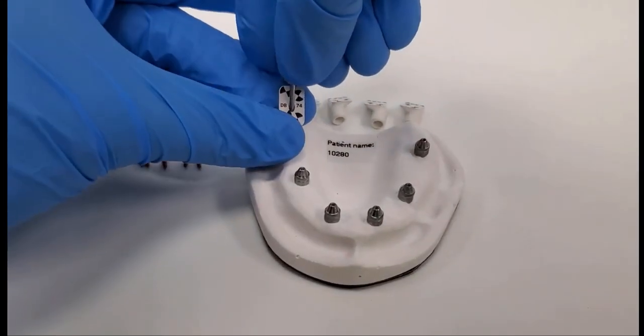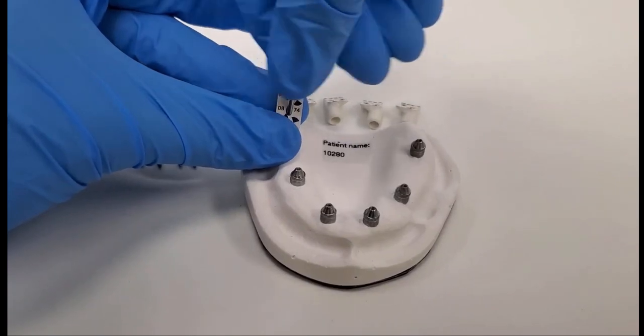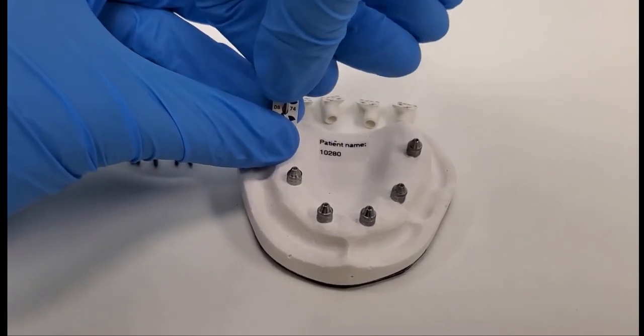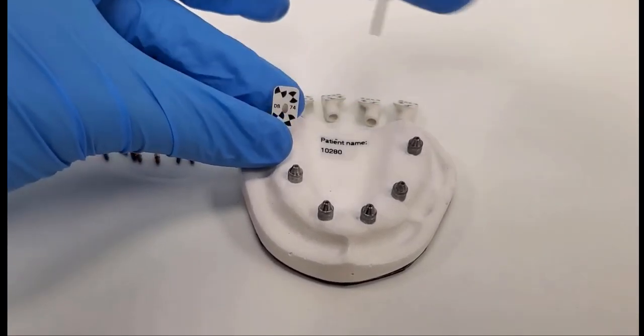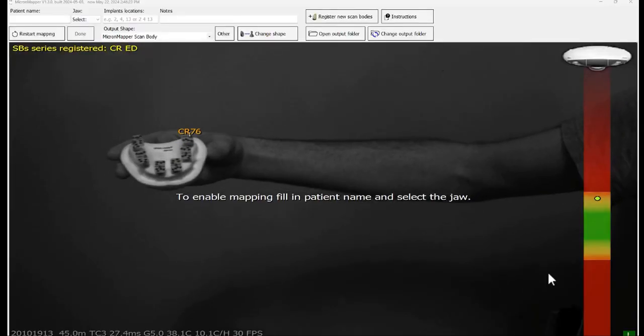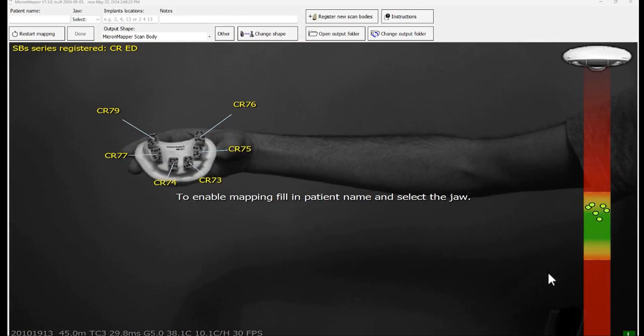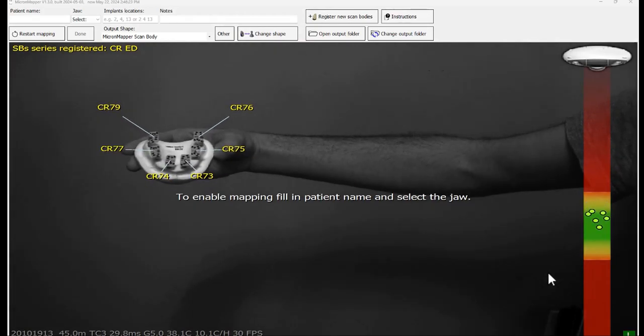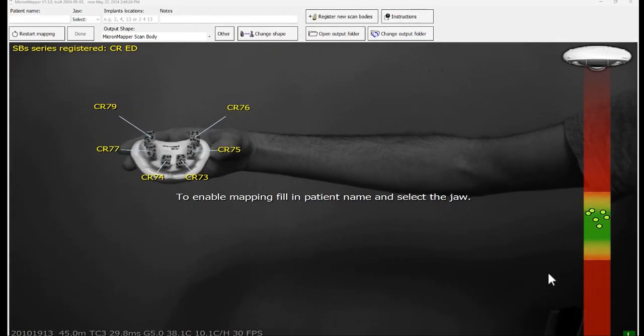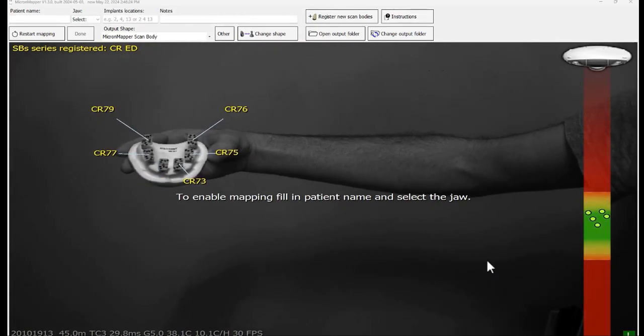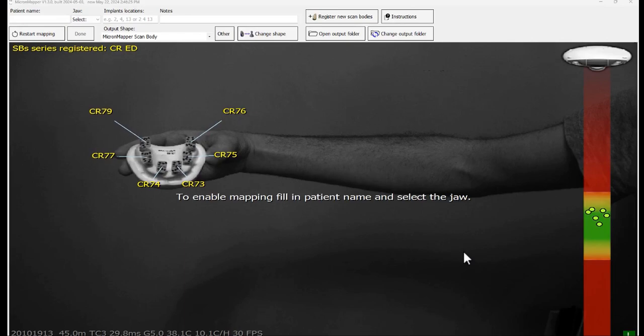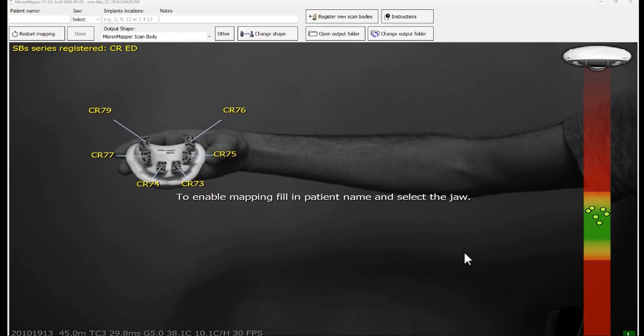The scan bodies should be facing forward. Keep them in the point of view of the camera and the scan body names should appear on the screen. You can validate it by seeing the number on the scan bodies. It should match.